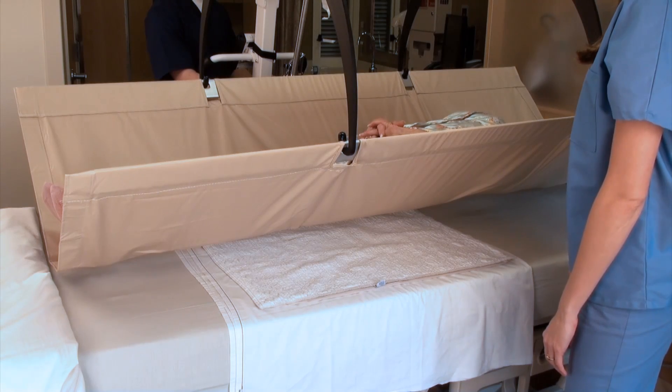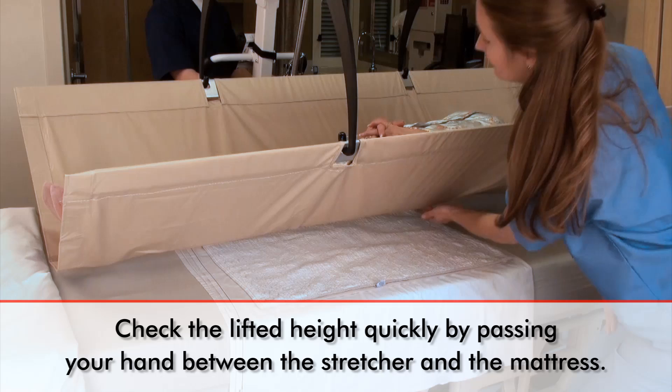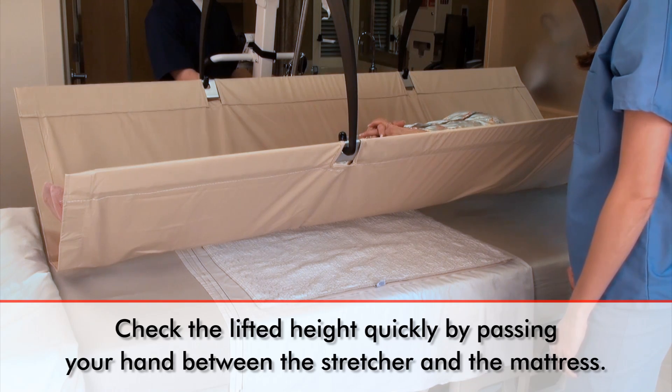It is good practice for the medical professional to quickly check the distance of the lifted patient from the bed by passing their hand freely between the stretcher and the mattress. This is all the distance needed between the lifted patient and the bed to receive an accurate weight.